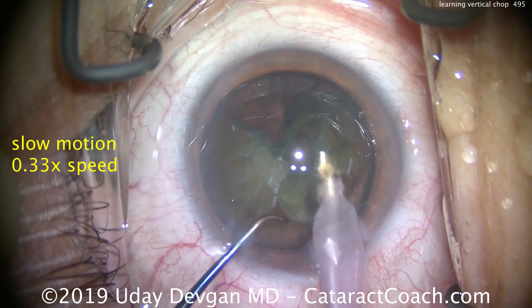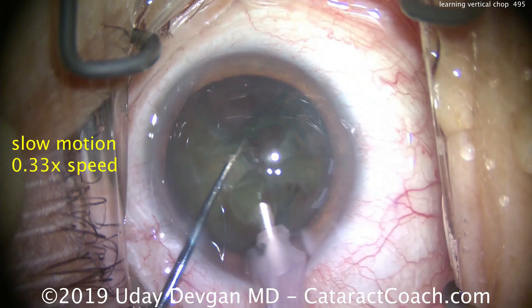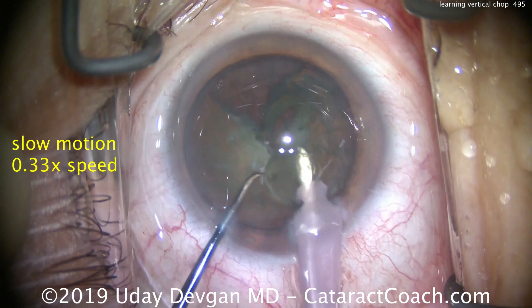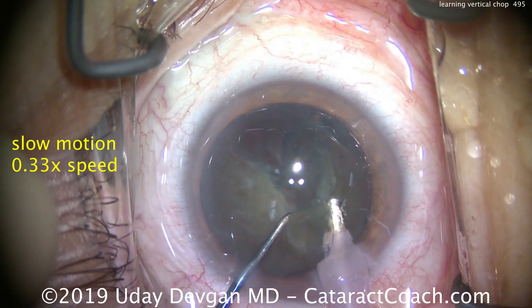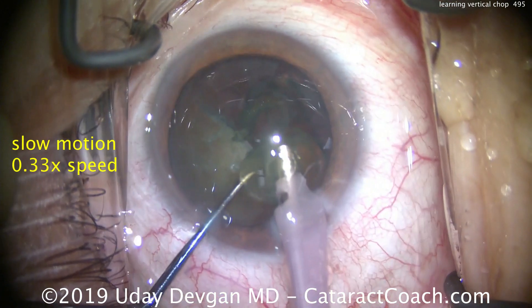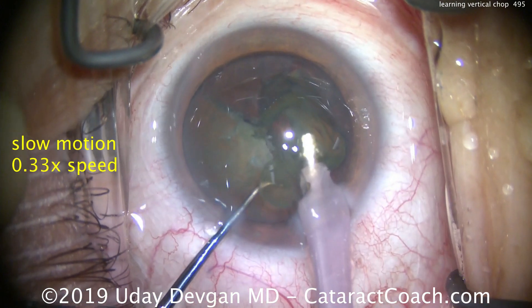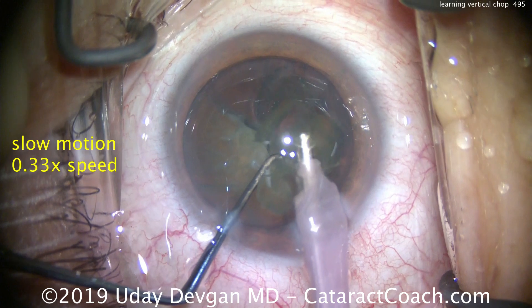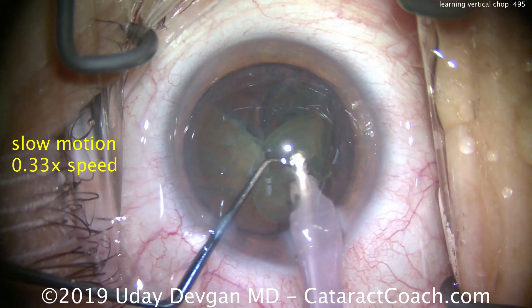That becomes relatively easy to remove. For settings, you need sufficiently high vacuum — with this phaco tip, you're looking at at least 400 millimeters of mercury vacuum. I like a sufficiently fast flow rate of 40 cc's a minute so things happen faster. You can use a lower flow rate, but the vacuum is what you need for holding power of the nucleus.